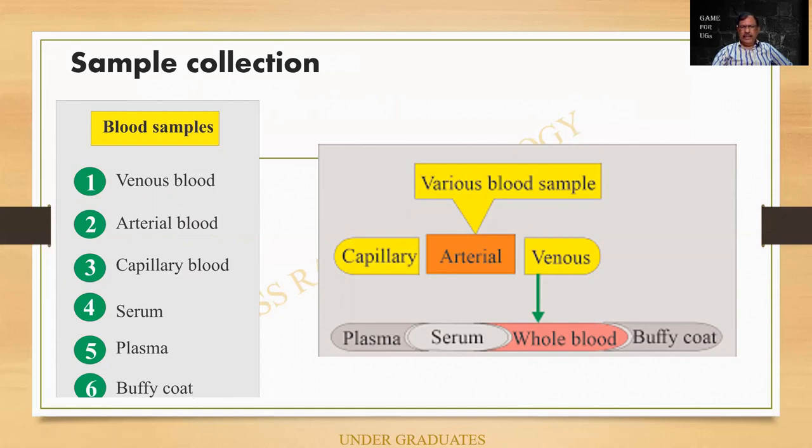I have explained it in my class on the PCV. Please go back to it in the chapter on gain. So these are the various samples, and I want you to kindly know it, because the examiner will definitely be asking different questions to different students. It is not difficult. The problem is we think it is not important and we pay the penalty for it.